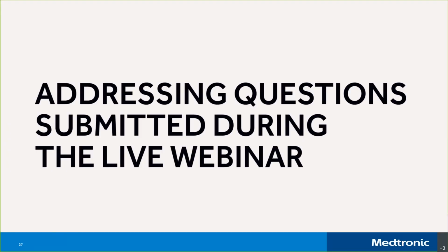Okay, so let's see some of the questions that have been submitted through the WebEx. All right, Rhonda, a couple ones that are coming through. We have one that says, what if I don't use the Contour NextLink meter? Are my blood glucose values still stored in my pump?